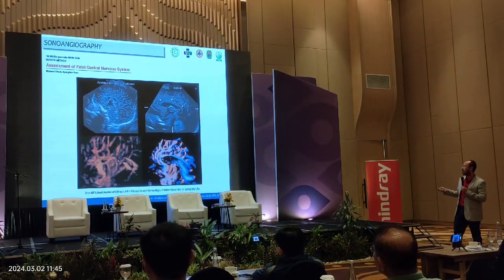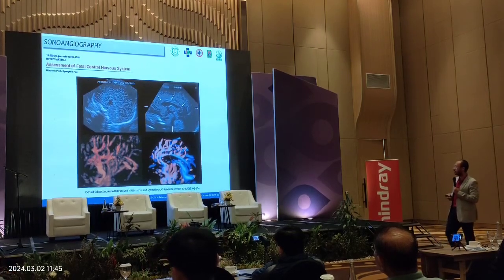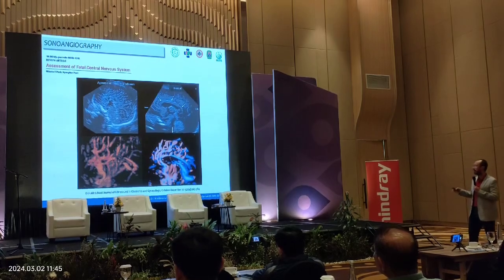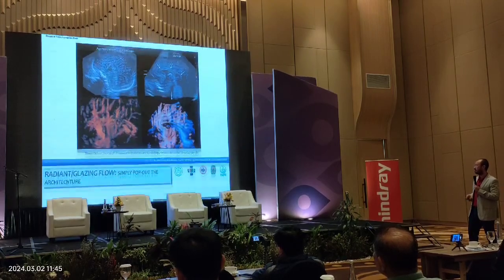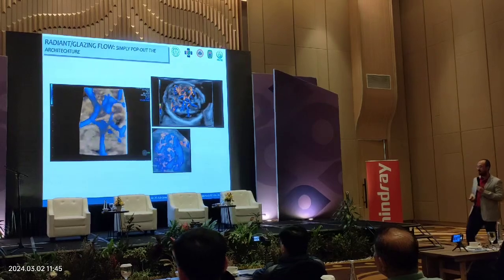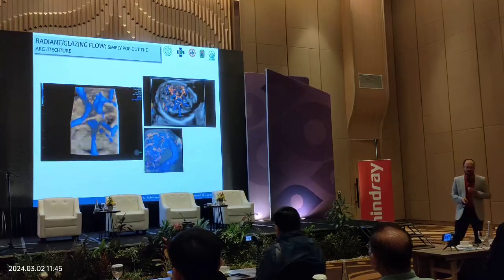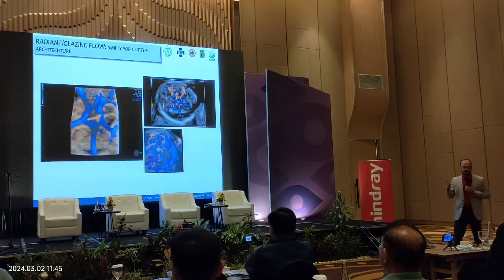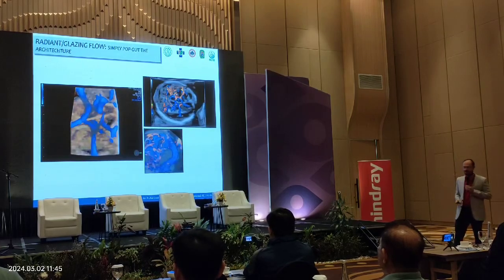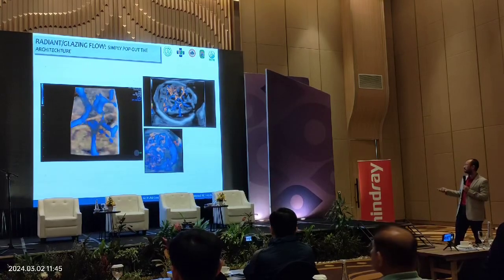Okay, this one is from research also. How can we differentiate between a normal corpus callosum and agenesis of corpus callosum by examining the pericallosal artery and also the callosal marginal artery. Technology is developing higher and higher. Like this, the vein of Galen malformation: we can see very clearly the turbulence of the blood flow until it drains into the sinus sagittalis.